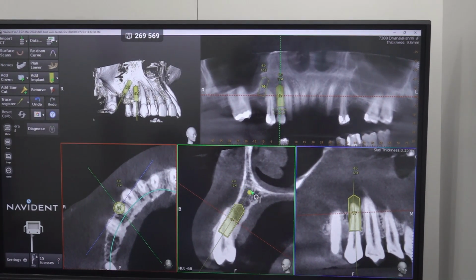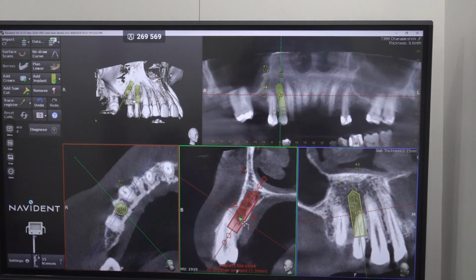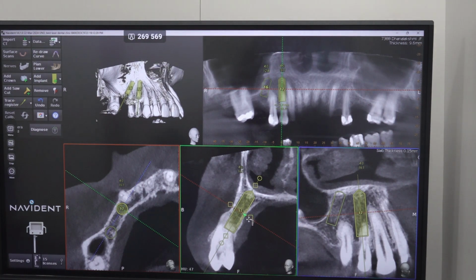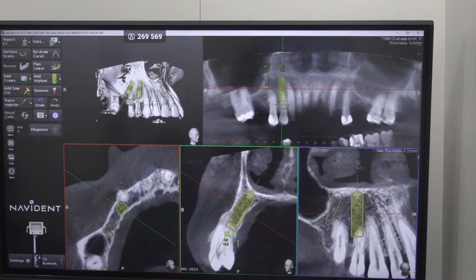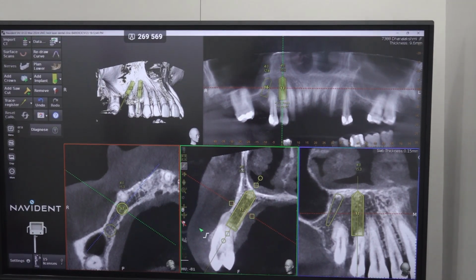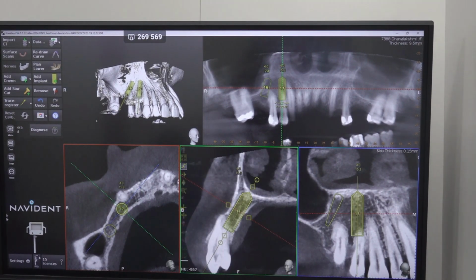Anyhow, we will be doing a lot of alveoplasty because the patient has vertical maxillary excess like this. Almost a 16 mm implant we can use. We will see the 3 ways.